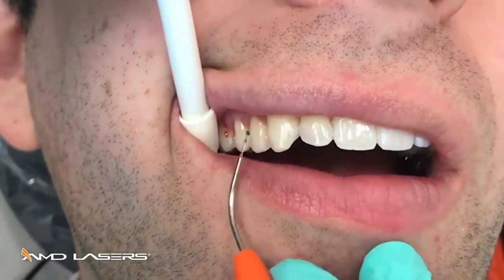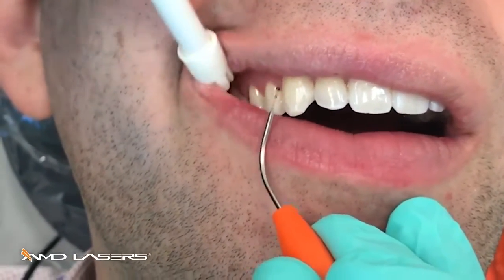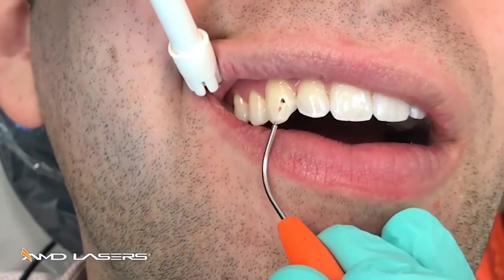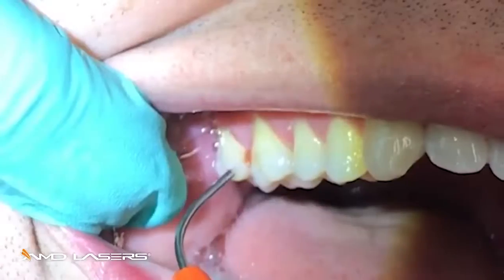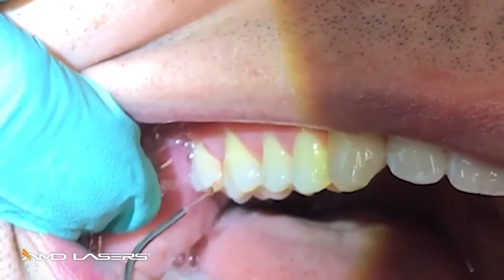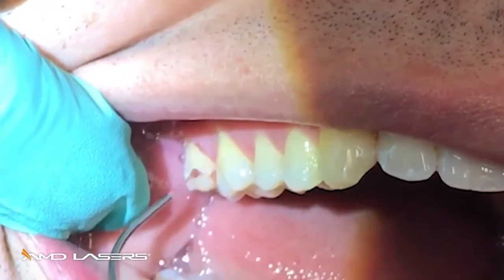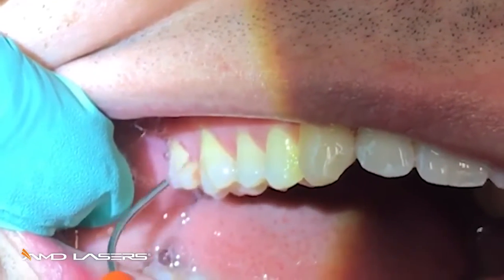This patient has no anesthetic whatsoever, because the tissue is dead — it doesn't hurt to remove it. See the little balls getting bigger and bigger. We're intentionally not using suction so you can see the slight laser plume that would be forming.